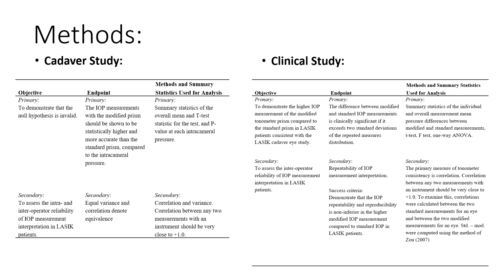The study protocol is designed to validate the modified prism's claims of improved intraocular pressure measurement compared to the standard Goldmann prism in patients who have undergone myopic LASIK. Two studies are part of a bifurcated justification.